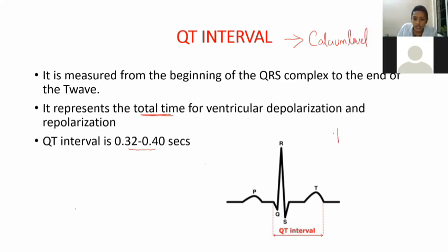If the QT interval is prolonged or increased, it will indicate decreased calcium level in blood, that is hypocalcemia.